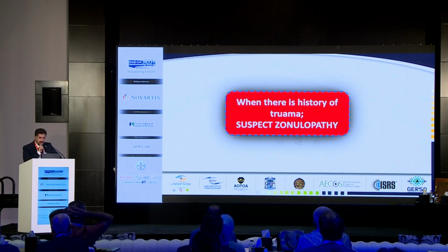Both cases have a zonulopathy, but every case has a history and special character on the slit lamp that gives you the clue that this case is not a regular case. This is very important.